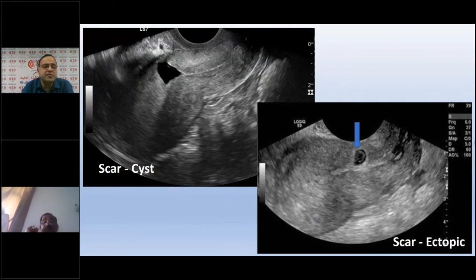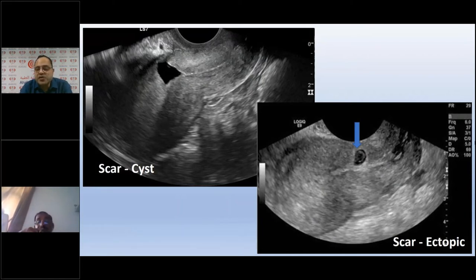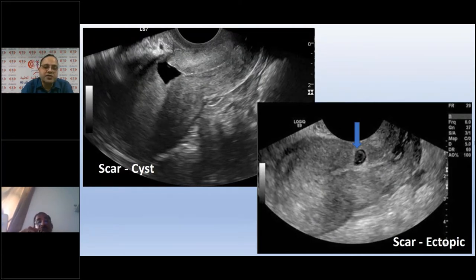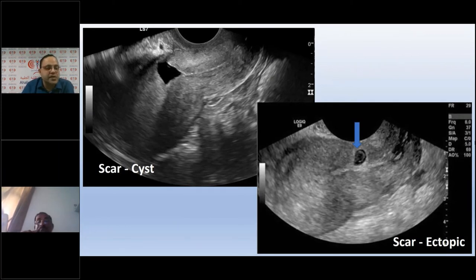It is important to differentiate a simple scar cyst from a scar ectopic pregnancy. A scar ectopic pregnancy shows a clear sac-like structure with an echogenic wall and a central gestational sac at the scar site — very different from a simple fluid collection. Knowing both appearances is critical.